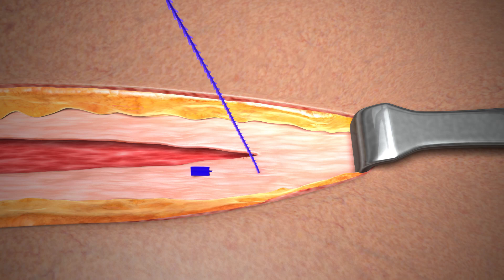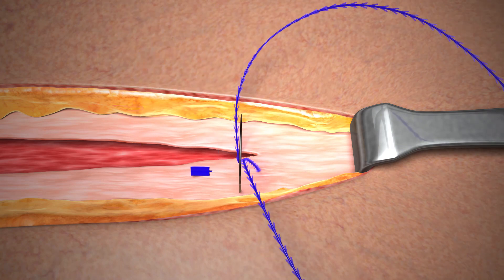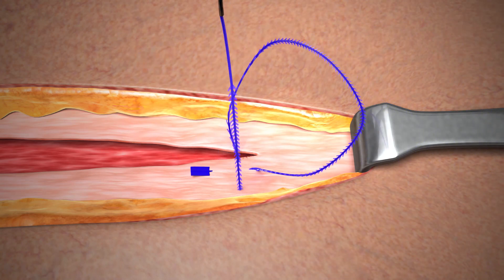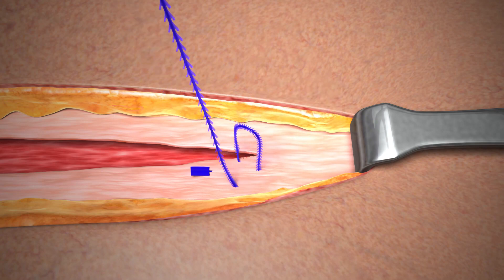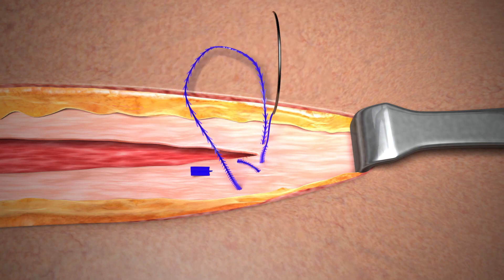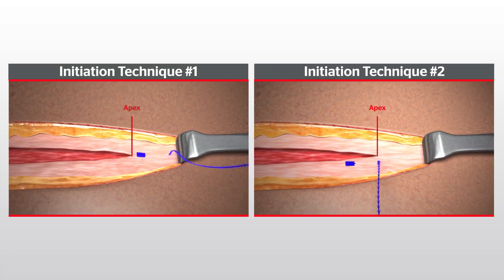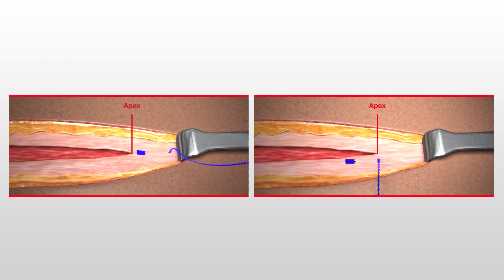The fixation tab should be seated above the intact tissue so that it remains visible. Do not exert additional force on the fixation tab or device. Moving toward the apex of the incision, take a pass in intact tissue perpendicular to the initial pass to lock the stitch. Multiple passes are acceptable. Pull gently on the device to take up any slack. Regardless of the initiation technique used, the remaining closure steps are the same for both.